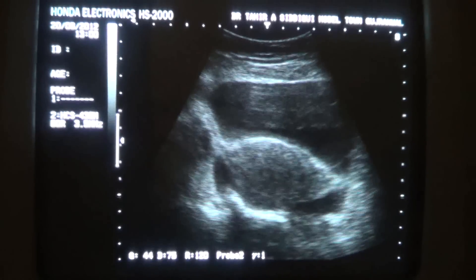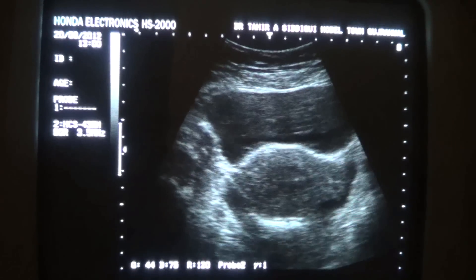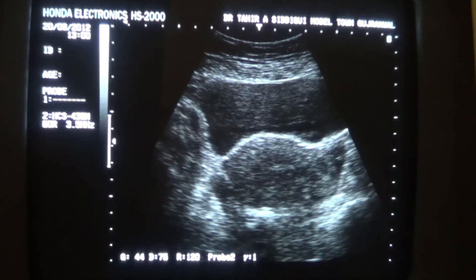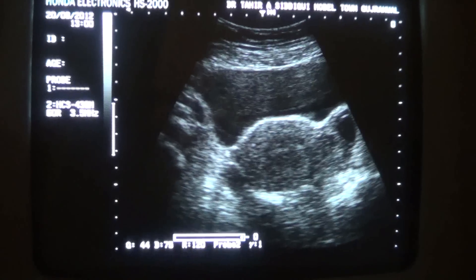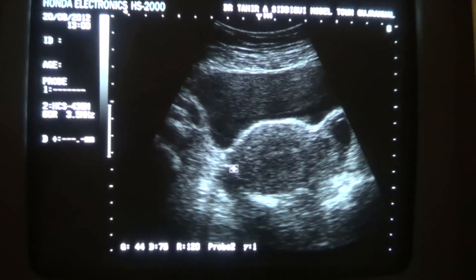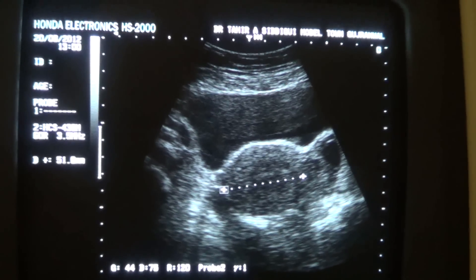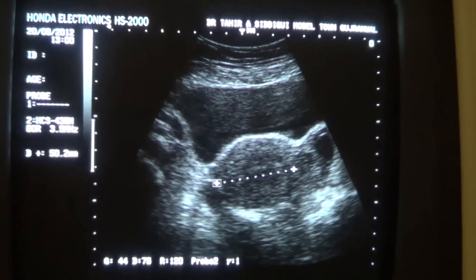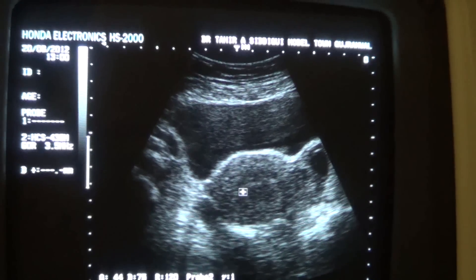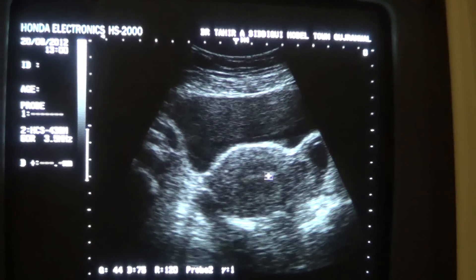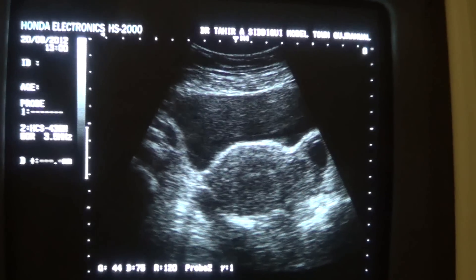In the transverse view, the uterus measures almost 5.0 cm, which is normal. This is the endometrial canal and this is the uterus.